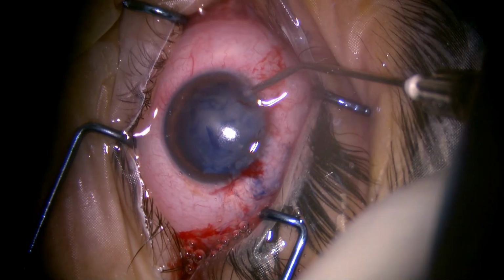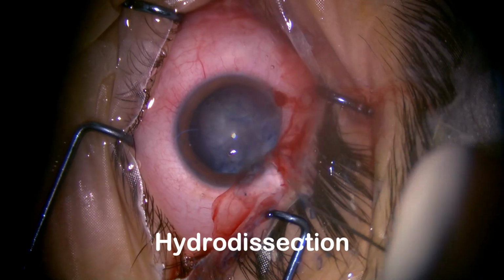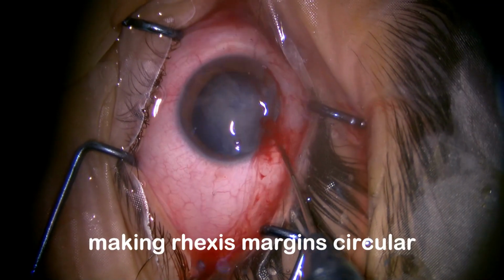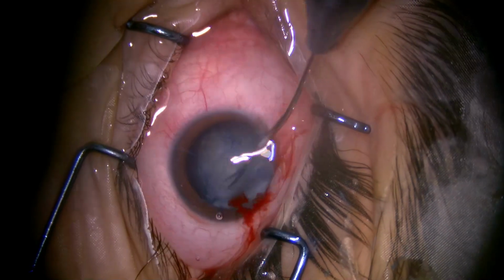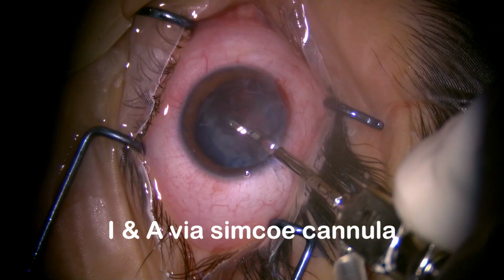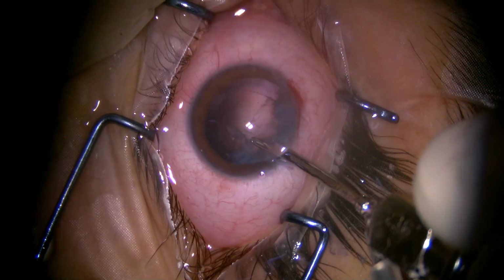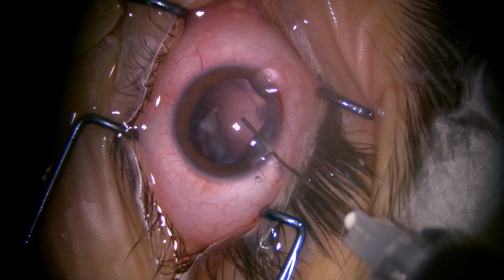Anterior chamber is formed. Limited hydrodissection is done since there is no clue regarding posterior capsular integrity. Cautious and controlled irrigation and aspiration is done using a Simcoe cannula in cases of traumatic cataracts. Anterior chamber is being formed.